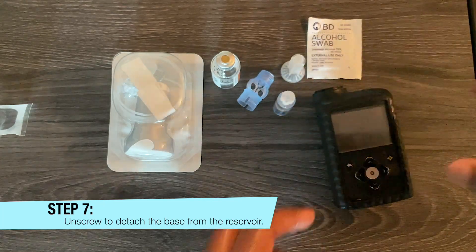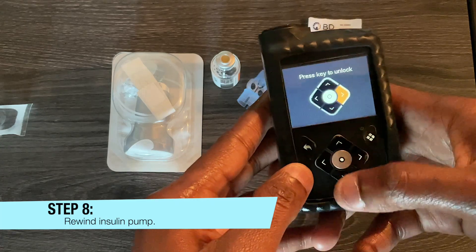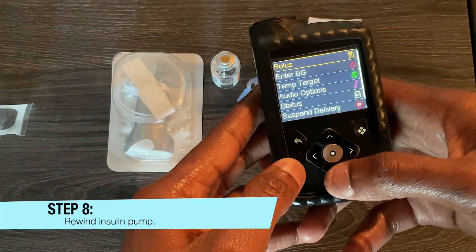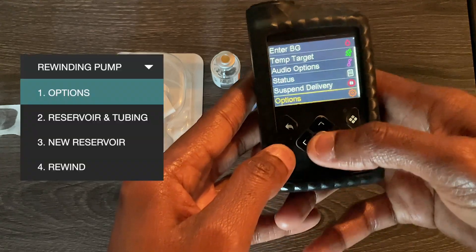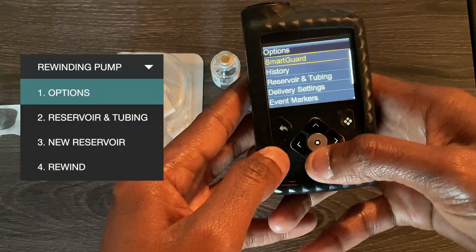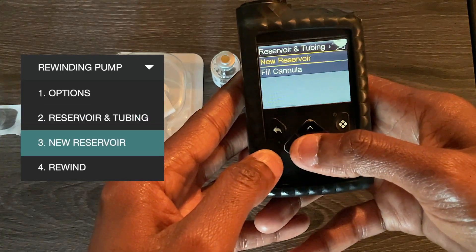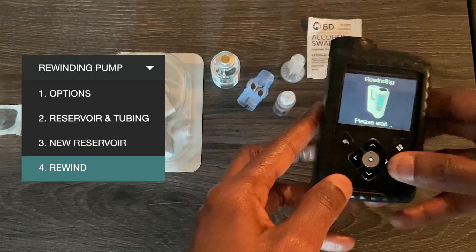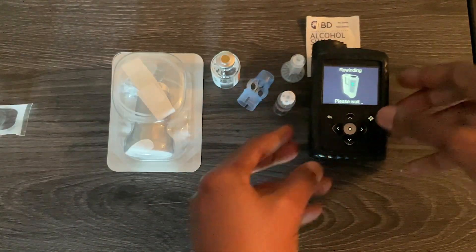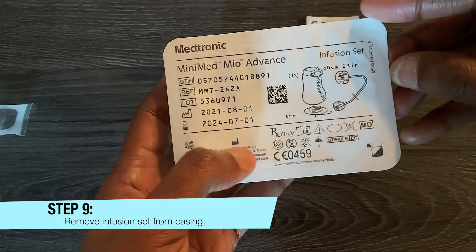Now you're going to rewind your insulin pump. Go down all the way to Options, then Reservoir and Tubing, then New Reservoir, and select Rewind. While it is rewinding, get out your infusion set.